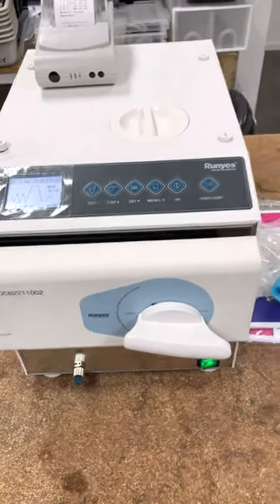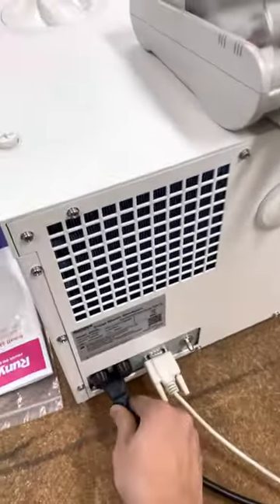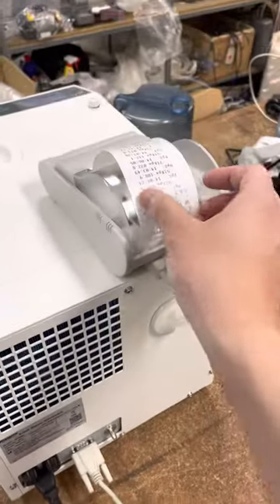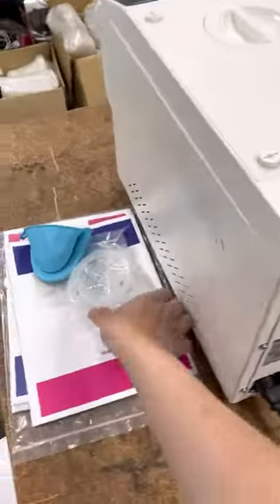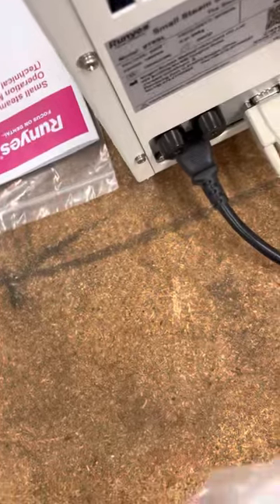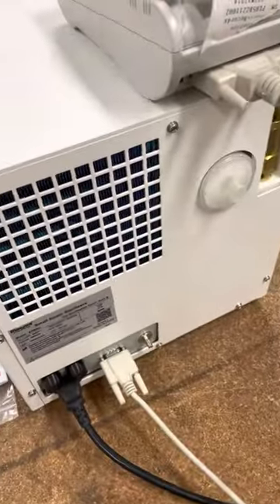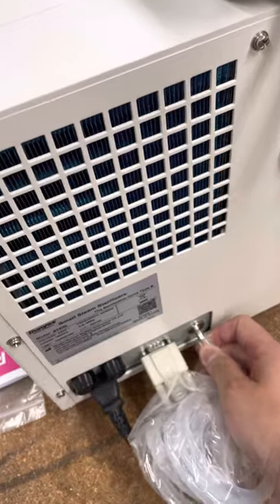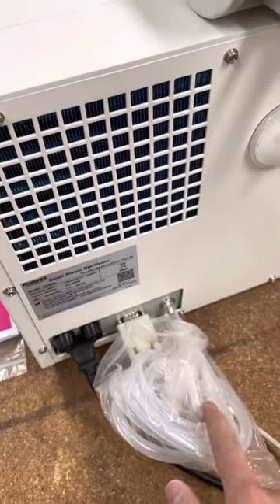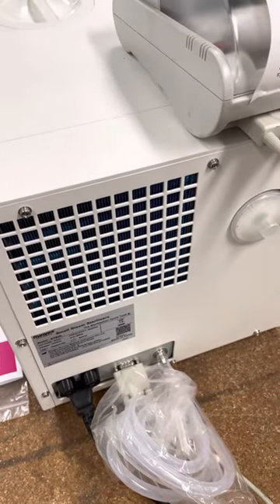While we are running the cycle, I'll also show you the components. There are a few things you have to do: the first is putting in power, and this is the printer where you have all the records. You also need to put in a drainage pot — you take out a drain, take out a hose, and plug it into here. Once that's secure, you run this hose to the closest sink you have and the autoclave will drain water automatically.